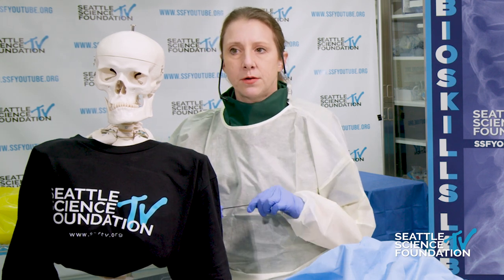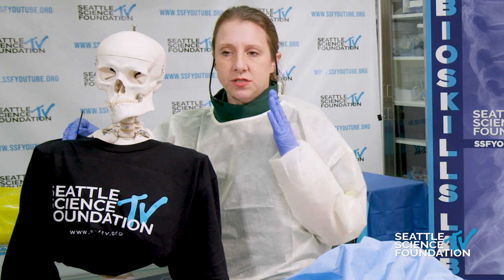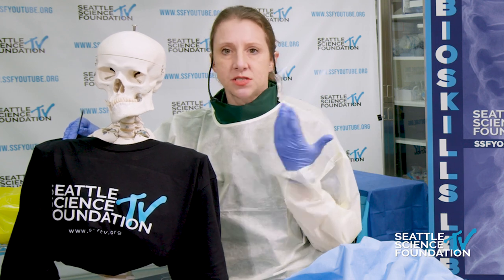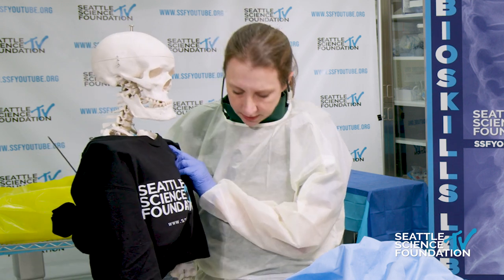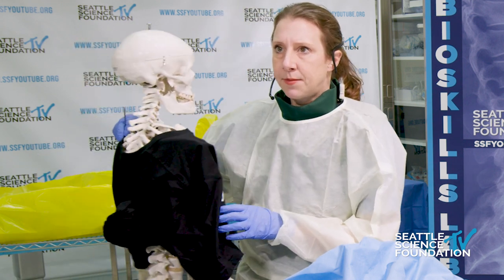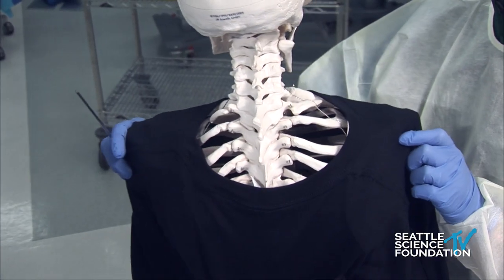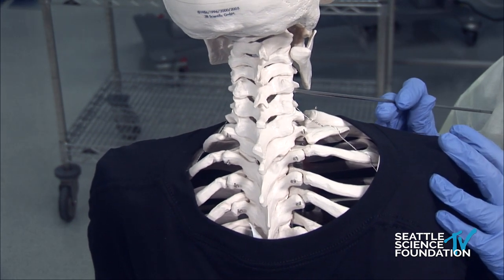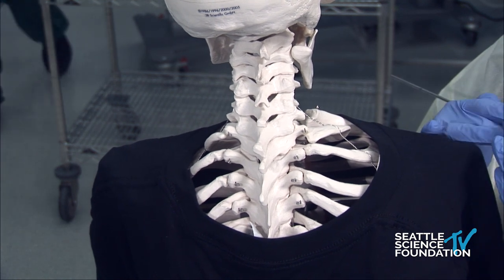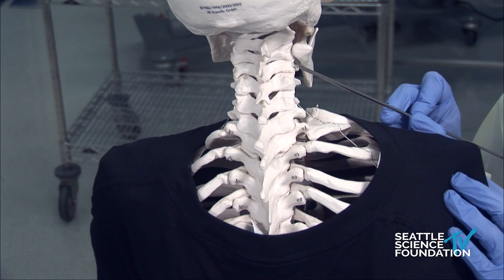I'll talk to you about what my technique is, which is really taken straight from the SIS, or Spine Intervention Society, recommendations. So if we look at the cervical spine to begin with, the facet joints, of course, are posterior laterally oriented. And the medial branches are going to be wrapping around from the side of the joints.